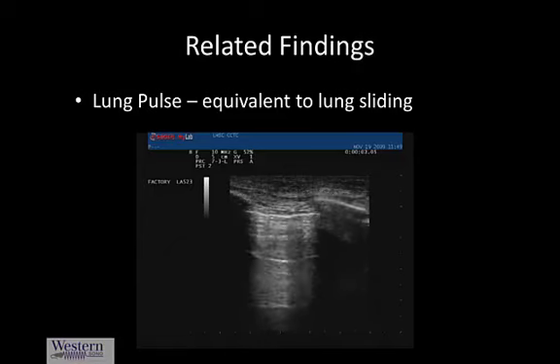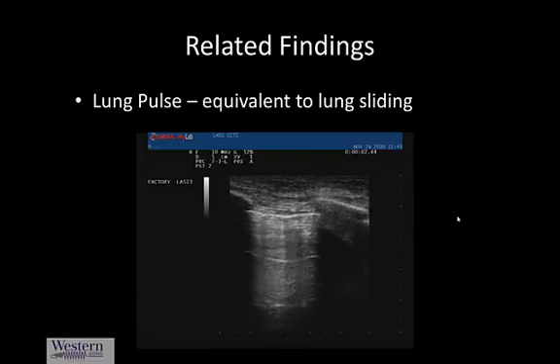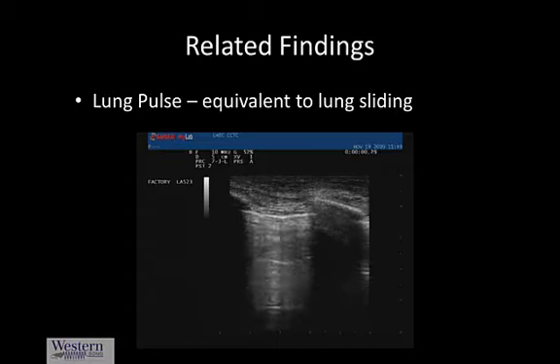It's called the lung pulse. So the lung is up because we say this is a main stem intubation. We see a rib shadow, and here we can see there is movement of the pleural line, and unless this patient's breathing around 90 breaths a minute, you can actually see that the movement of this line is in cadence with the cardiac activity. And this movement is caused by the physical reverberations of the heart and the way it jostles the lung around, which includes the two layers of pleura, creating a lung pulse. So to check this out, just hold your breath next time, put the probe on your own chest, and watch your own lung pulse go to work.